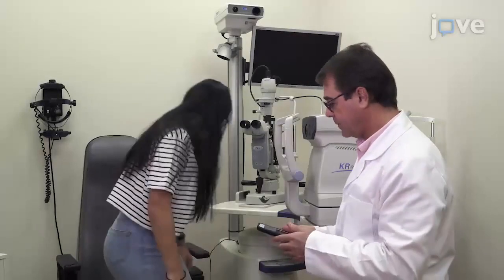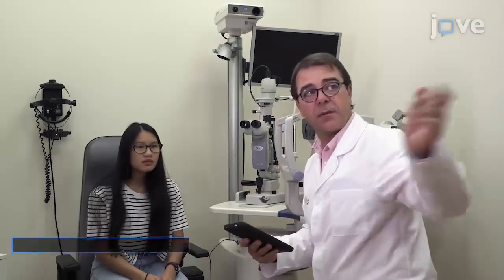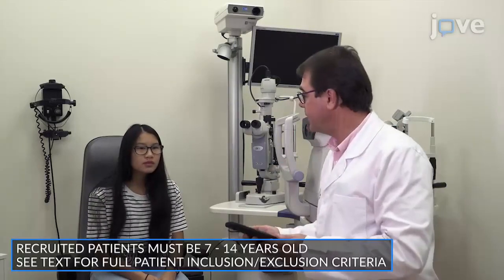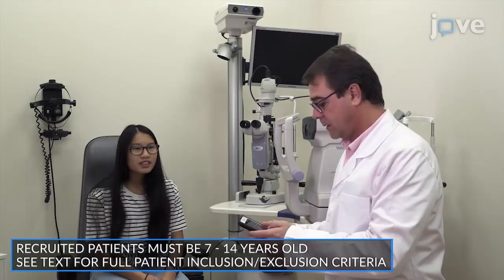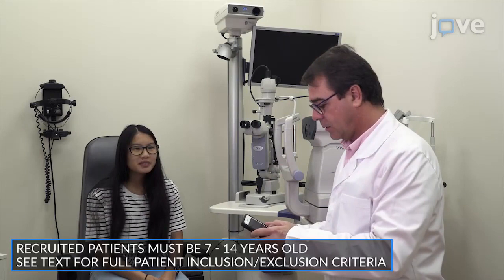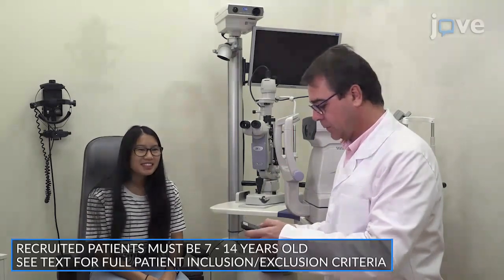Before beginning the training, perform a baseline optometric evaluation to ensure that all of the appropriate inclusion and exclusion criteria have been met. Measure the best corrected distance logarithmic visual acuity with a digital screen.